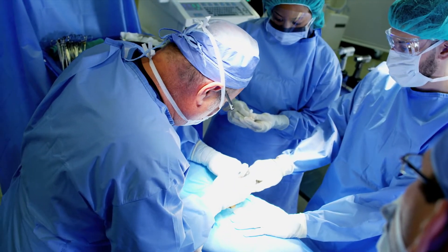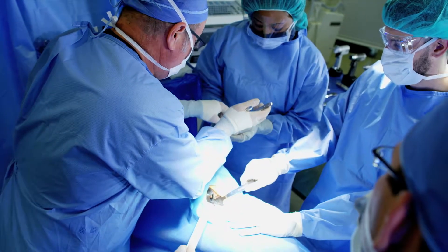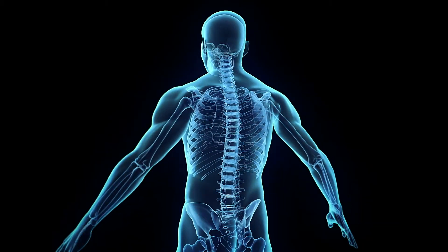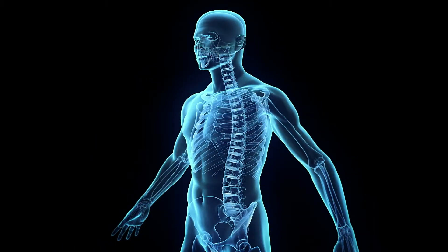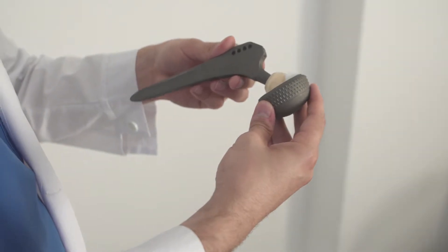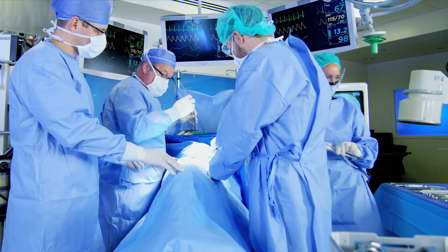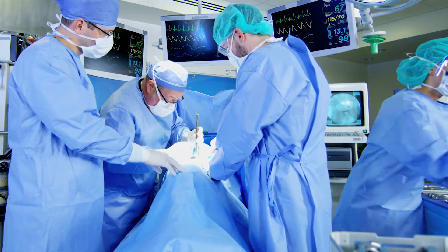Orthopedic surgery can be tricky. Doctors often take a bone graft from a patient's own body or even a cadaver and try to refashion it into the shape they need. Replacement parts made of metal sometimes don't fit just right, and existing bone substitutes have their limits.